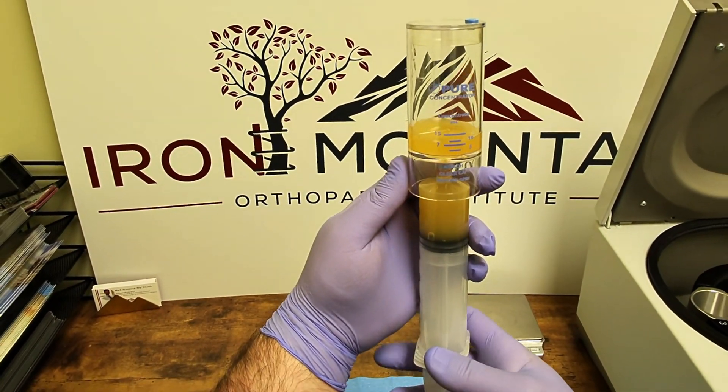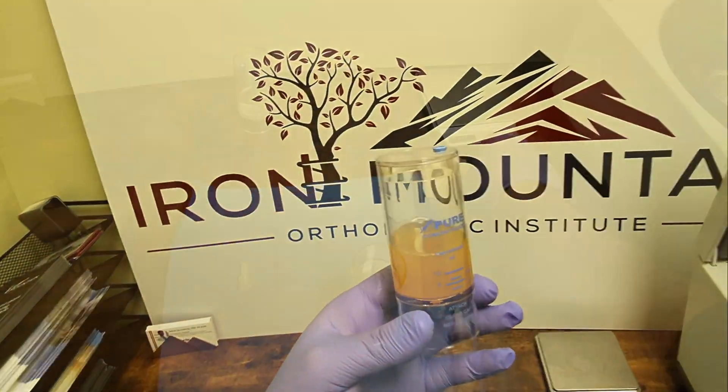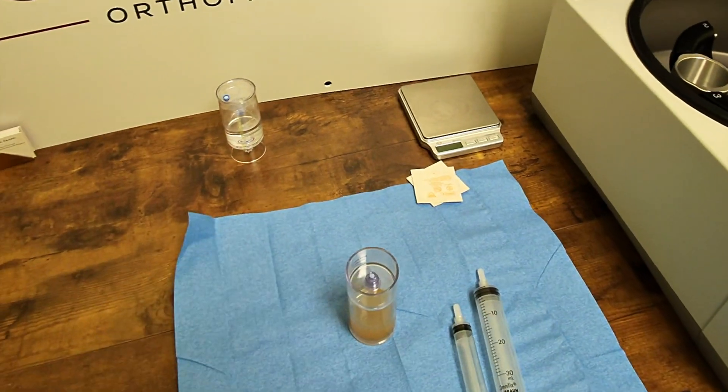Next, the platelet plasma suspension is transferred to the concentrator device. A cap is placed onto the port to prevent the suspension from escaping during centrifugation.